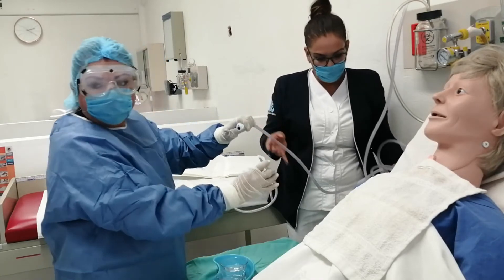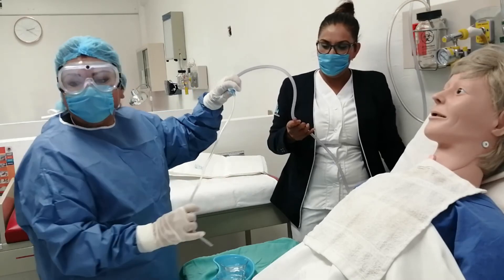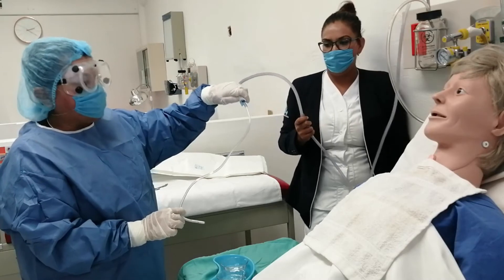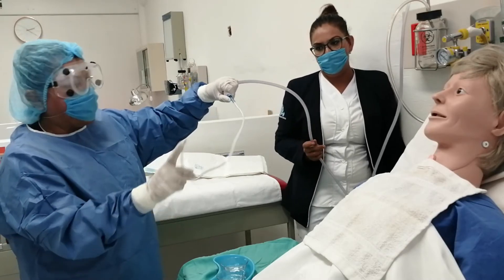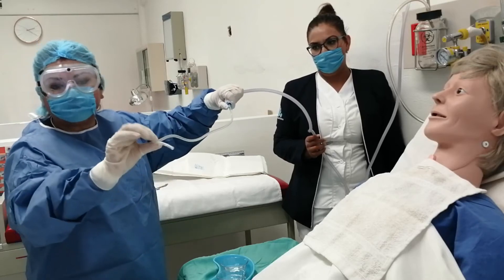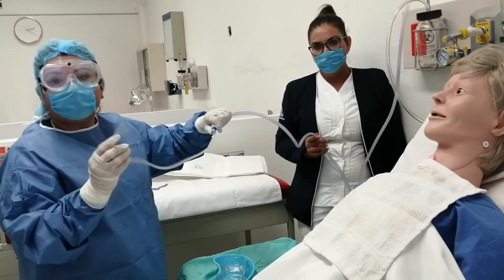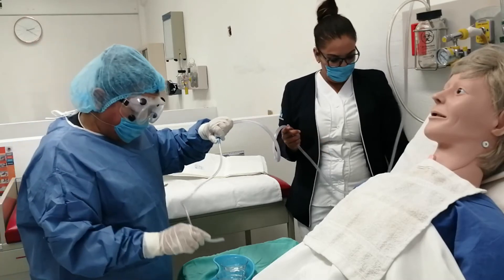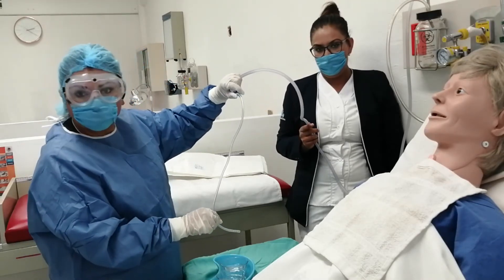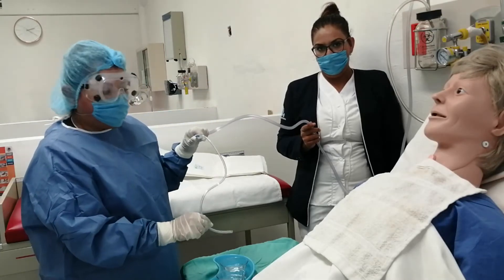Procedemos a insertar la sonda en el tubo. Tiene una pequeña valvulita: si está abierta, no aspira; si la cierro, la presión negativa se traslada y empieza a succionar. Verificamos que efectivamente esté aspirando: se puede ver cómo la solución sube, lo que quiere decir que el aspirador está funcionando de manera correcta.